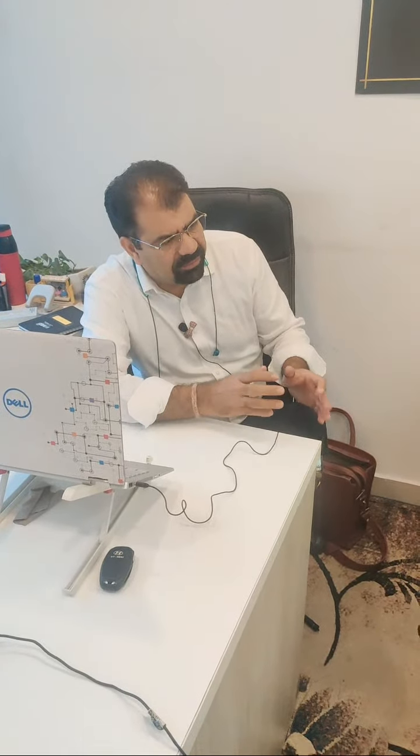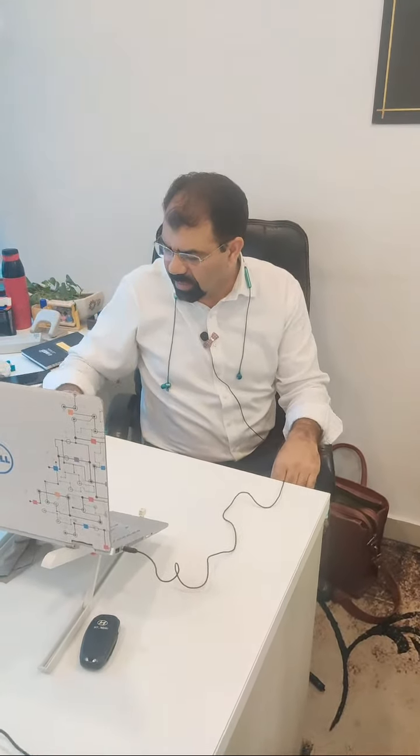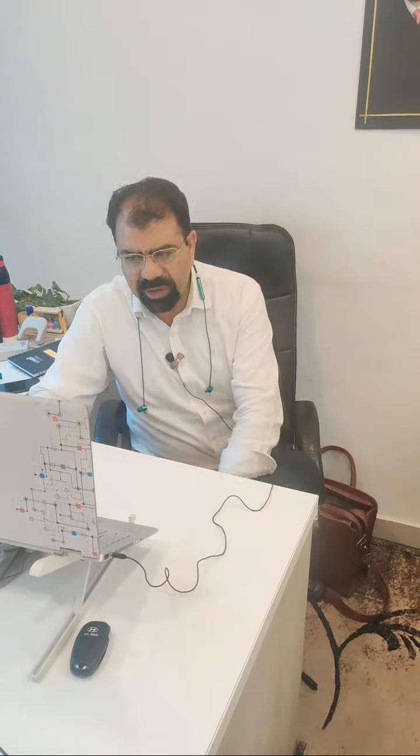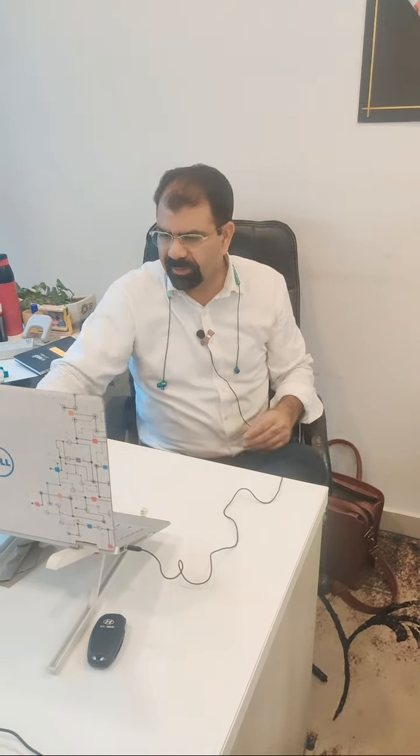Today we'll be taking a short vlog about ultrasound in female infertility. I'm highlighting that this is not a training course. Right now, what we are taking is not a training course, but a very short vlog. So let's start.